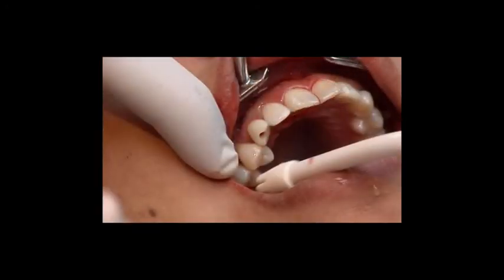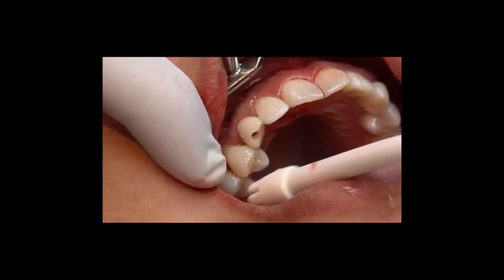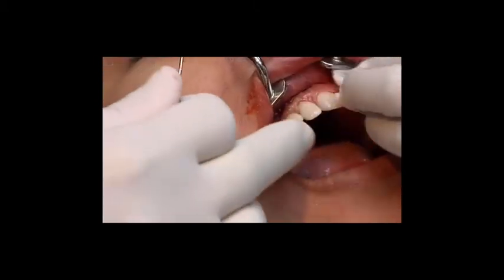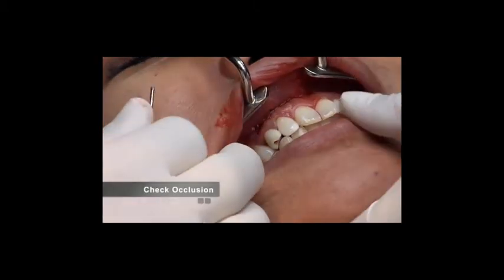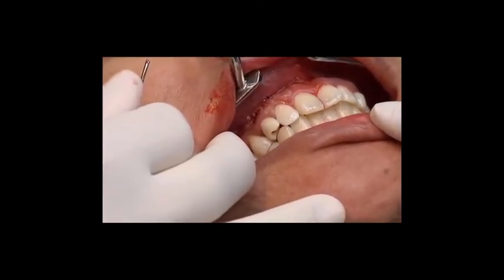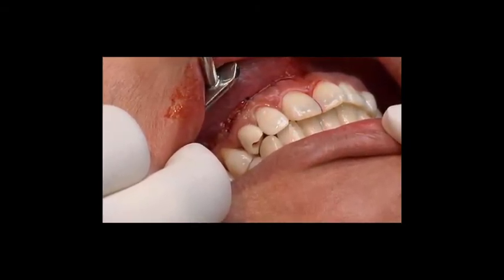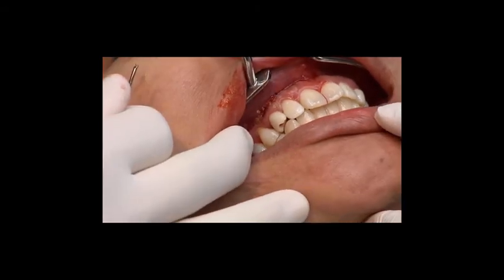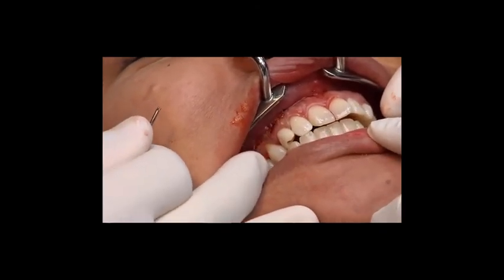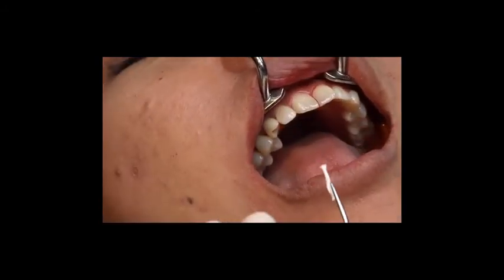And then obviously make sure to check the occlusion so that it's completely out of occlusion. That is really, really important. There should be absolutely no occlusion in any centric or excursive movements. At times when that's the case, the provisional, you can see here, there's absolutely no contact. At times when that's the case, the provisional becomes a little bit shorter and sometimes may not look as pretty as a typical provisional, but that is just the compromise that you have to make when you immediately temporize these type of cases. Really, really important, again, to check it in all excursive movements. Just make sure there's absolutely no contact on that provisional.